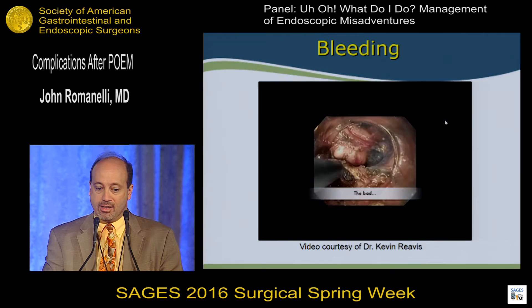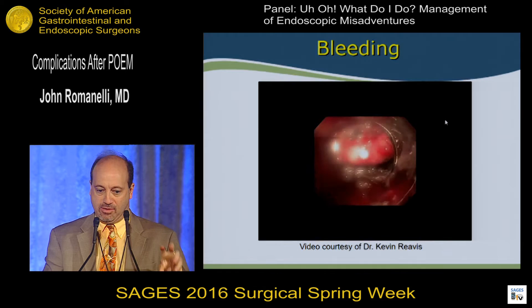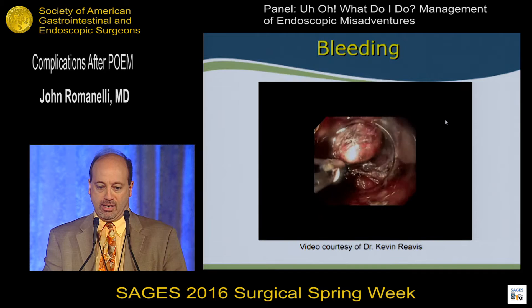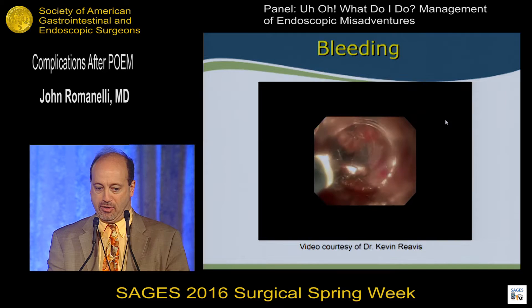Sometimes it's a bigger bleed — not quite a variceal bleed, but a pretty big vessel. You can see we're tamponading with the scope a little bit, which gives you time to take a breath and get the tools you need. Again, we're going to use the biopsy forceps. An advantage of the endoscopic cap is it's more difficult to splash the view with the bleeding, so you're more likely to stay in vision. The biopsy forceps was able to stop it.